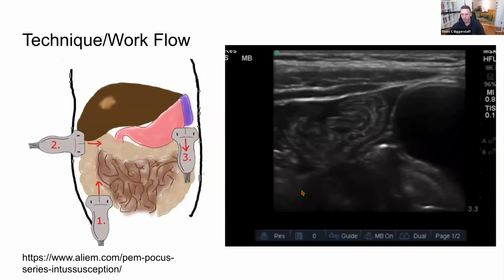Large bowel intussusception often is going to require intervention by radiology to do an air enema to reduce it. Small intestinal intussusception oftentimes resolves spontaneously and doesn't generally cause the same variety of symptoms. But here we're just tracing the cecum.